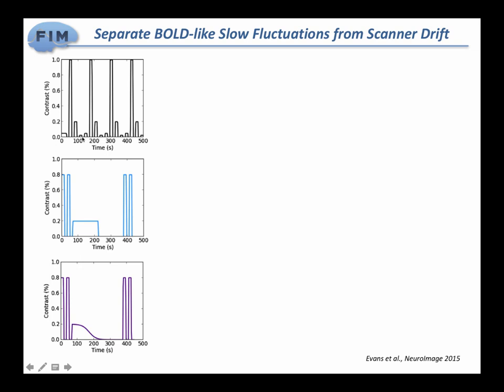If they were too long, we wouldn't know how to separate that from the drift. But she also played with 2 other designs, one in which she has these very long steady blocks of stimulation over 100 seconds, so longer than a minute, maybe even a minute and a half, and this one that looks like a graded stimulation but also very long.